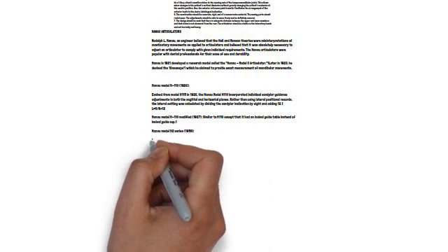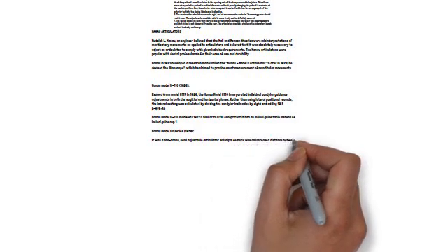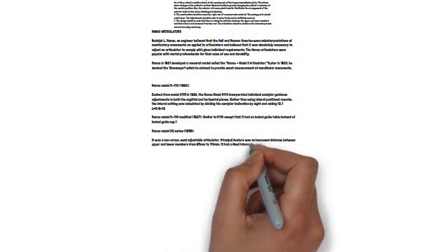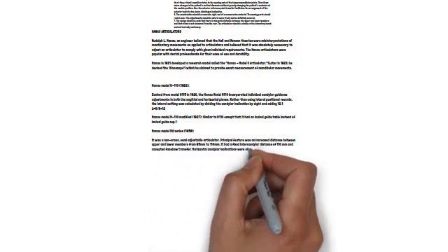HANA Model H2 Series, 1958. It was a non-Arcon, semi-adjustable articulator. The principal feature was an increased distance between upper and lower members from 95 mm to 110 mm. It had a fixed intercondylar distance of 110 mm and accepted face-bow transfer.